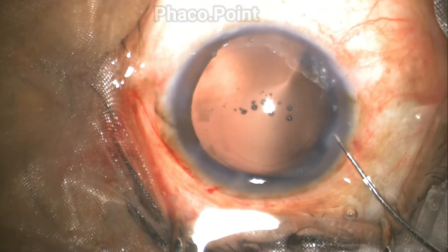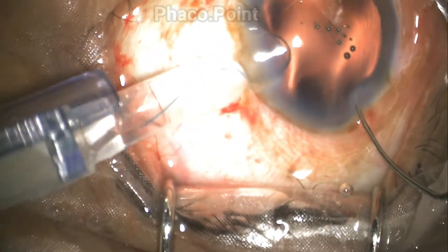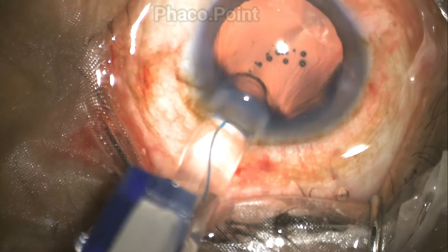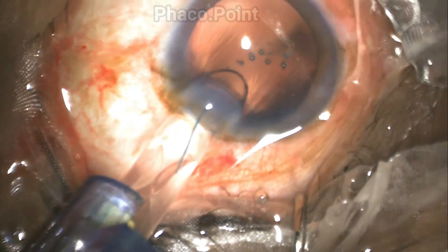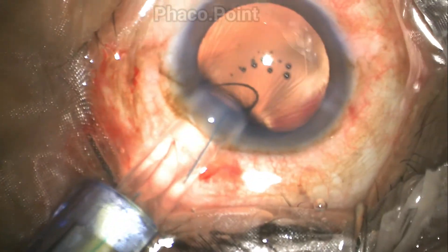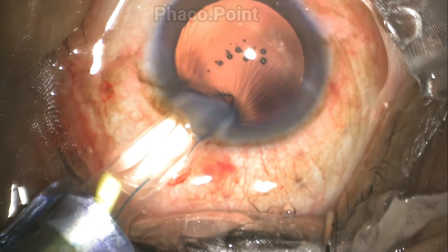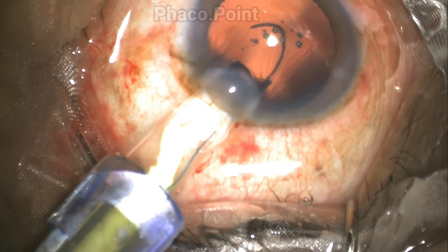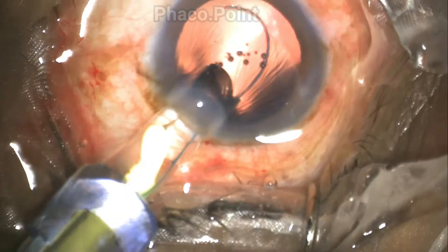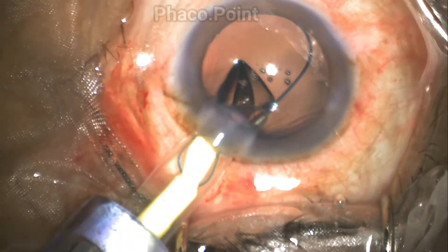Counter pressure is given by the Sinski hook through the side port incision, and the nozzle is introduced not just within the wound but also into the anterior chamber. As discussed, the entire cartridge-injector system is turned towards the right, and then in a controlled manner the plunger is pushed so as to allow the leading haptic to come out as desired into the capsular bag.